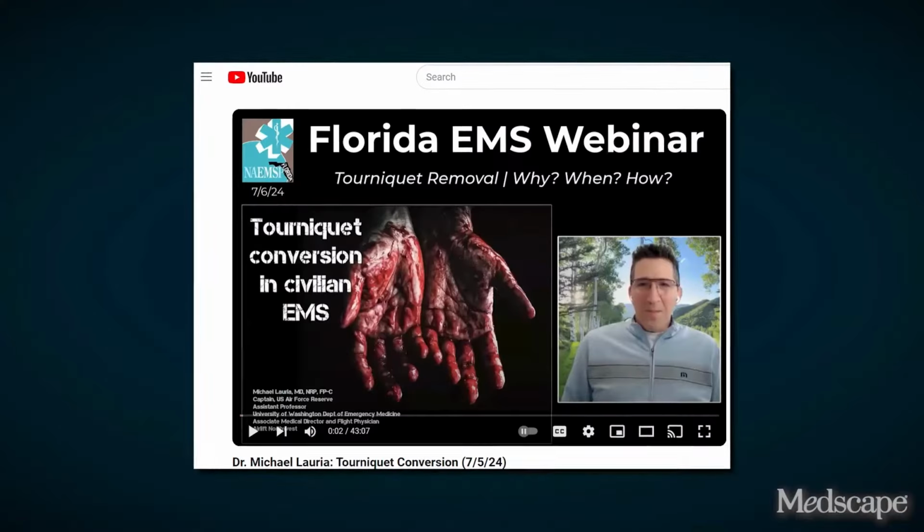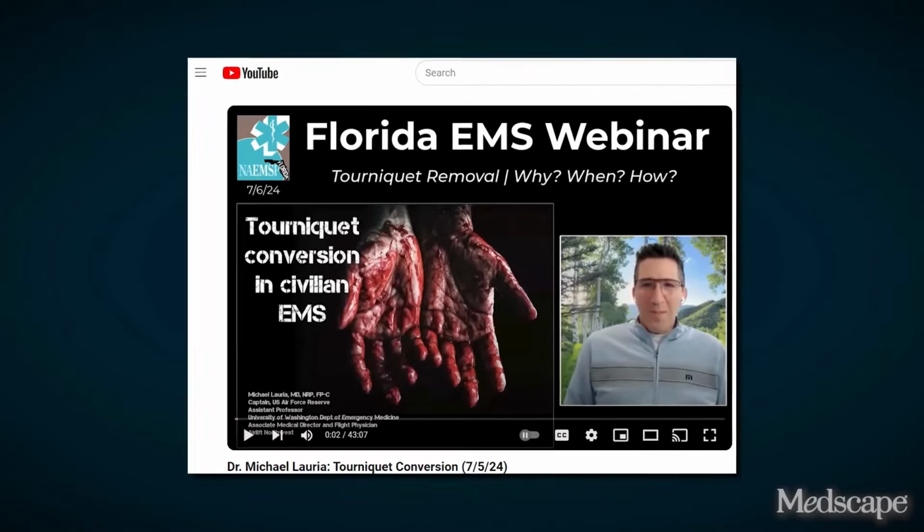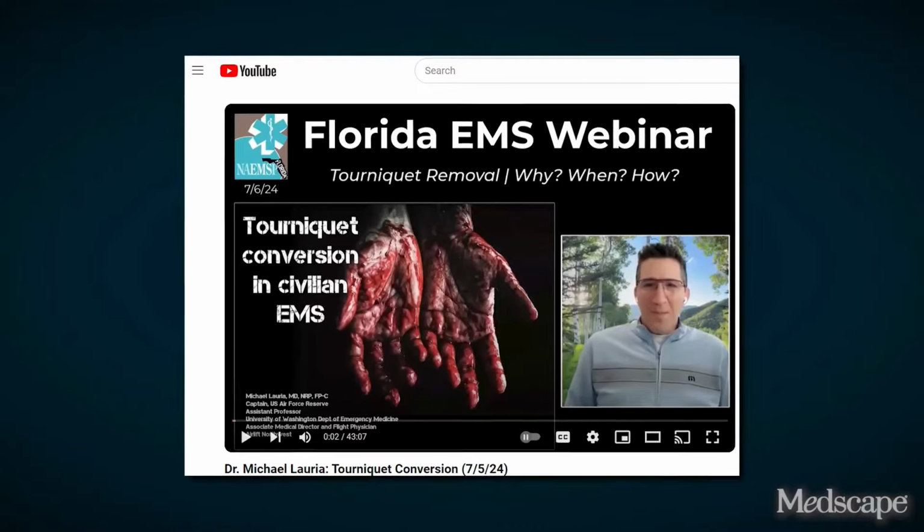On the flip side of that, there's something called tourniquet conversion. It's exactly what you mentioned. It's making sure that the tourniquet doesn't stay on for too long of a time. And if you can imagine a patient going to an outlying hospital where there's no trauma center, and then that patient has to be moved a couple hours to the trauma center, could you potentially have a tourniquet on for too long that then ends up causing the patient a bad outcome? And the answer is yes.